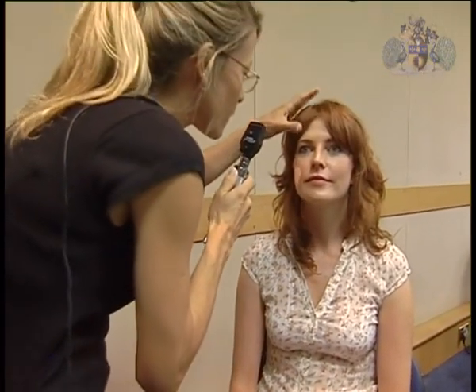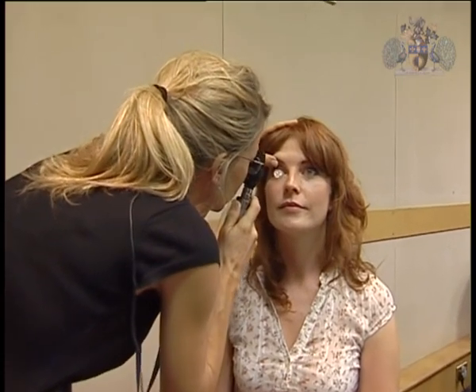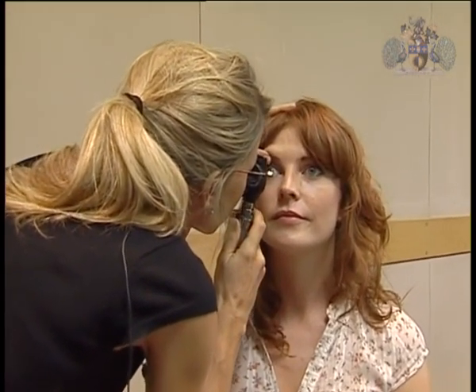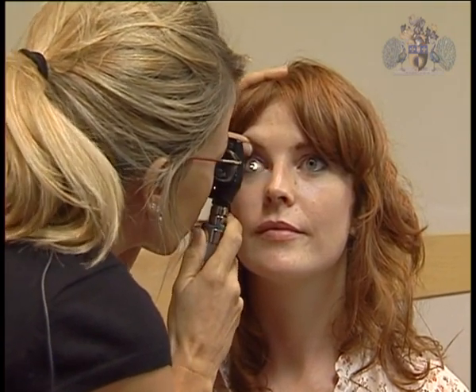Examine the fundus. Examine the right eye first. Looking through the ophthalmoscope eyepiece, move in to look through the pupil. You need to get closer than you think.